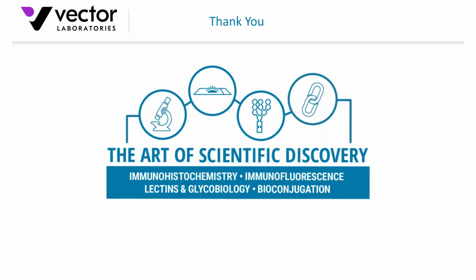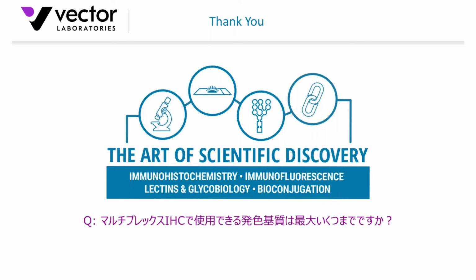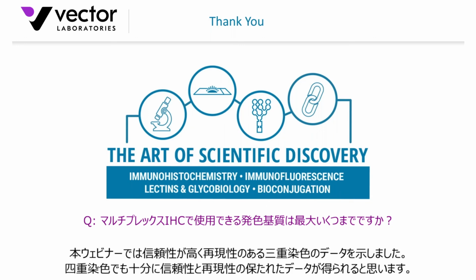Okay, great. The next question is, what is the maximum number of enzyme substrates that I can use in multiplex IHC? Fair enough. So we have shown in this webinar successful, reliable, reproducible localization of 3 colors. I think at one point we threw in a 4th as well.